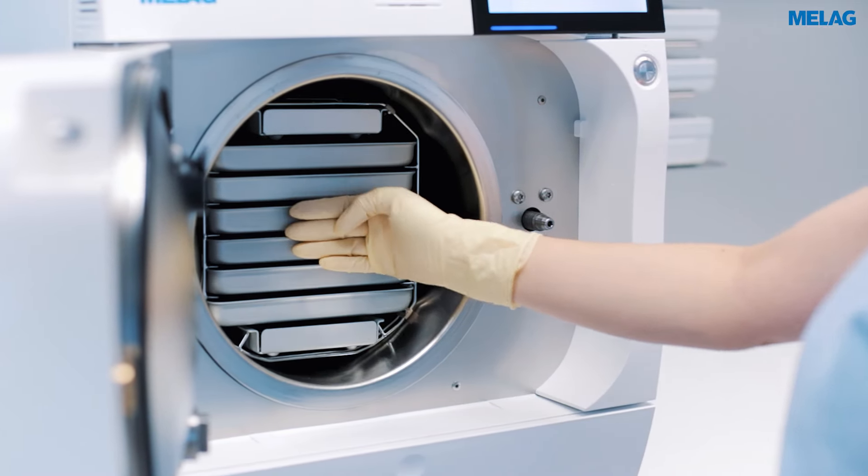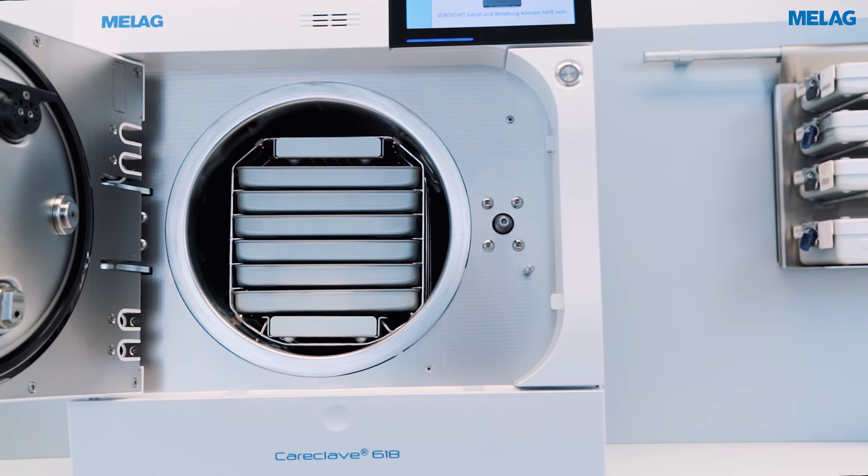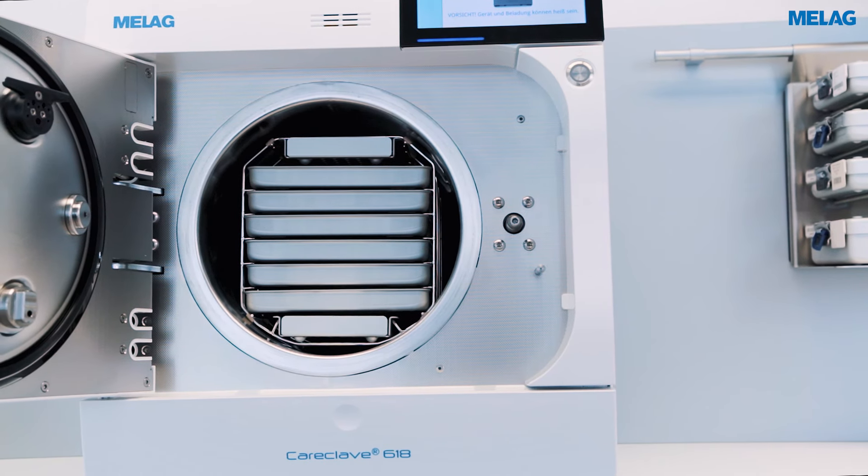If you need the maximum capacity for sterilizing your instruments, you can also use Careclave as a high-end autoclave. Without the Carebox inserted, the display switches to VacuClave mode.